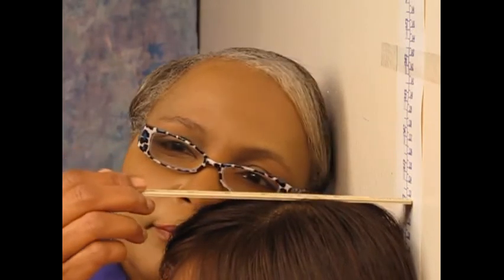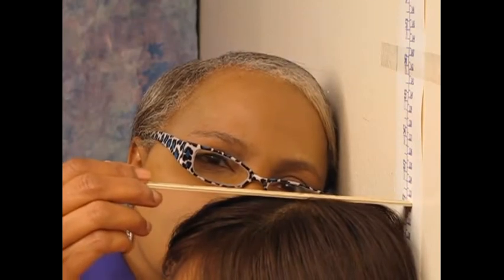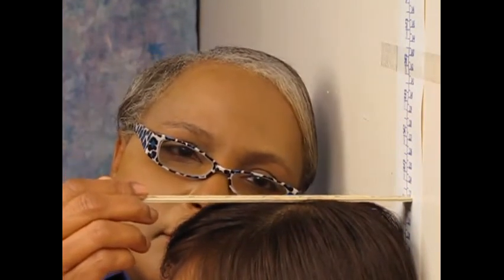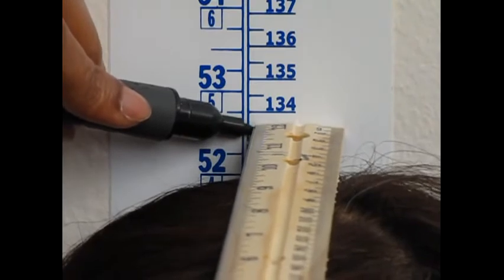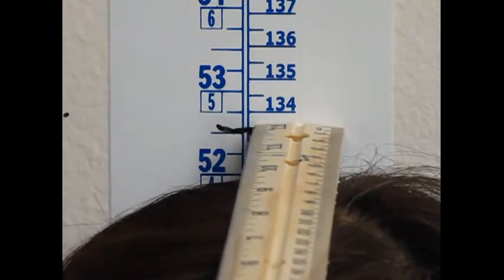Now that you've positioned your child correctly, you're ready to measure their height. First, stand to the side of your child and place the ruler firmly on top of their head and against the height chart. Your eyes should be at the same height as the ruler to make sure it is level. When the ruler is level and touching the top of your child's head, use the marker to draw a small line where the ruler touches the chart. Mark their height in the center of the chart for easier reading.